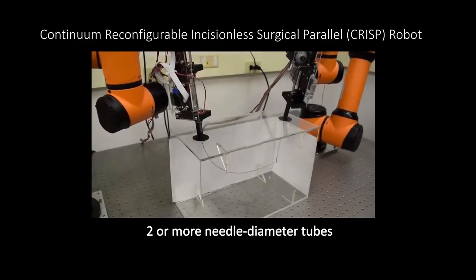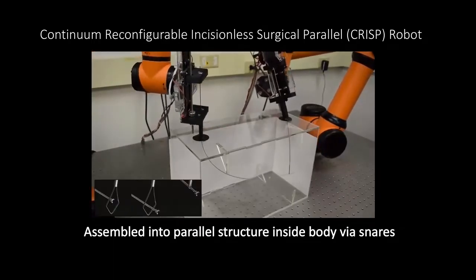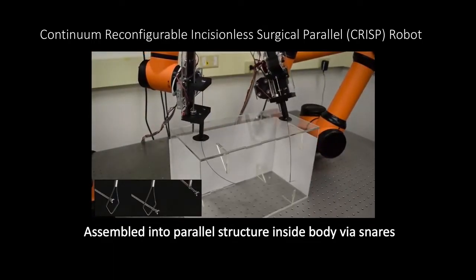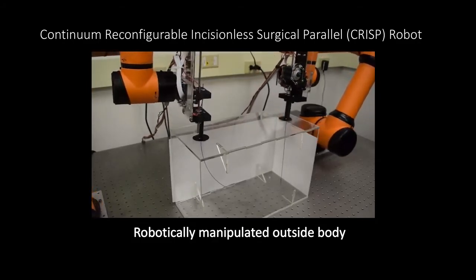The CRISP robot consists of 2 or more needle diameter tubes that are inserted into the patient's body and assembled into a parallel structure via snares, which allow the tubes to grip one another. The tubes are then manipulated robotically outside the patient's body, changing the shape of the structure inside the body.